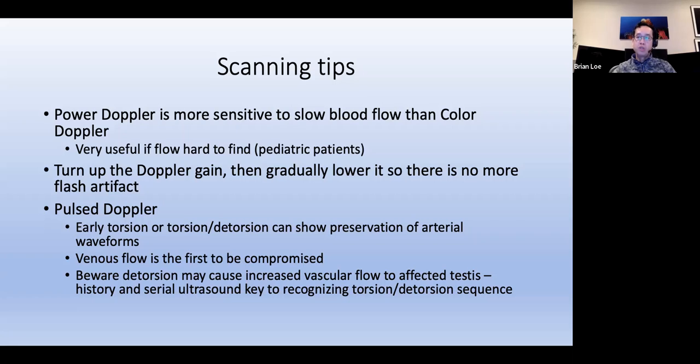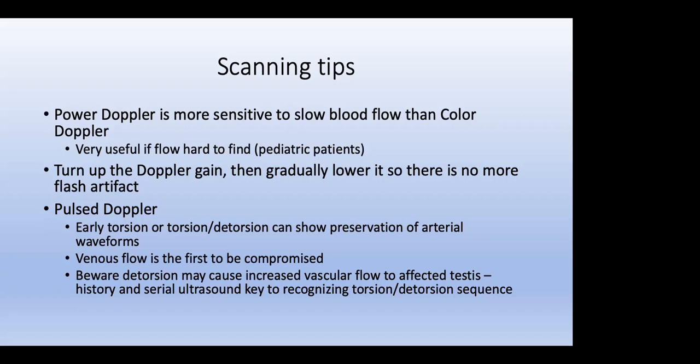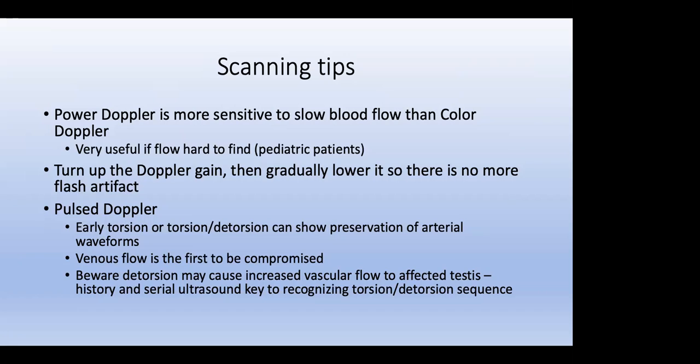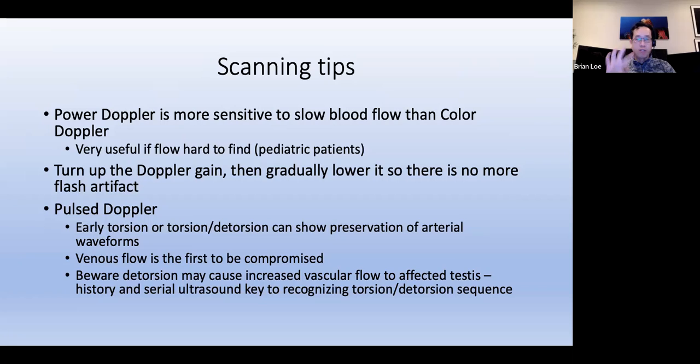So you don't just turn on the color Doppler and then look, because sometimes movement and even breathing will fill in the color map with an artifact. That's not true color flow. So what you need to do is hold it still, turn up the gain until you see what we call flash, where it's just flashing on the screen, and then you decrease that gain, and then you wait, and you look for structures that have a color flow map but are regularly pulsatile. That's when you know that there's flow there. We also use pulse Doppler. That's a more advanced technique, but is also useful for us.